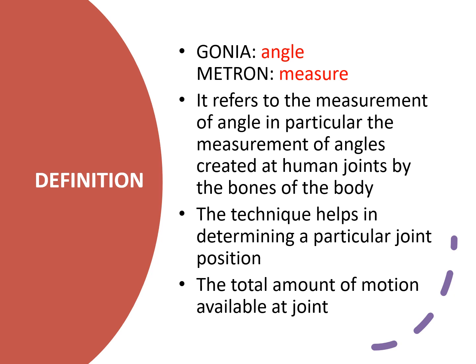In a patient population, it might change, it might reduce. That is why this technique is very important to find out the cause, or how much the movement is reduced in a particular condition or patient. That is why goniometry is very important when you're dealing with patients.